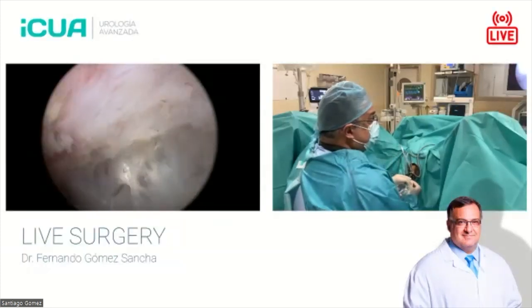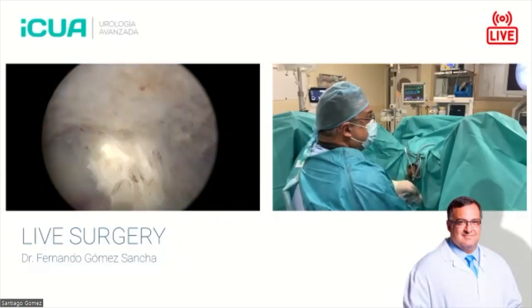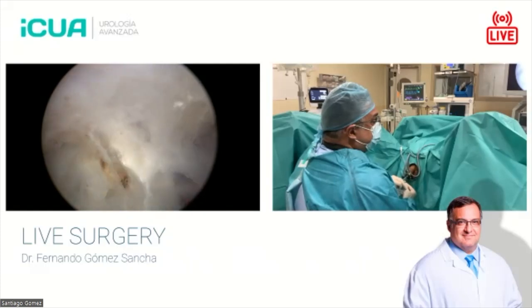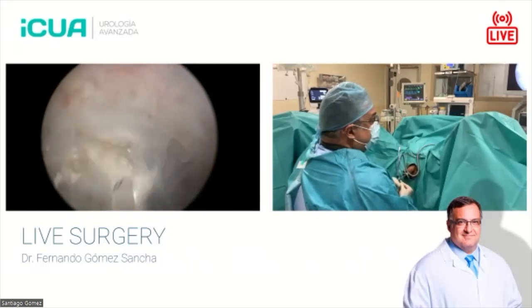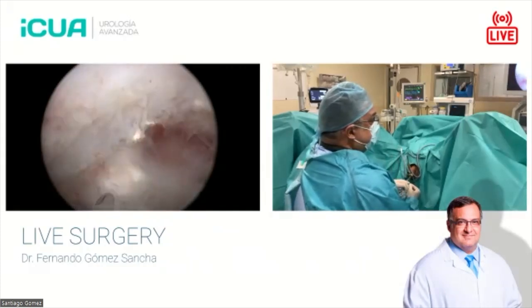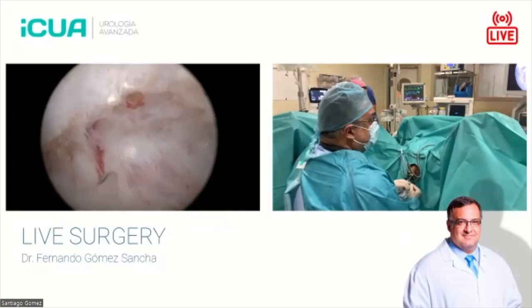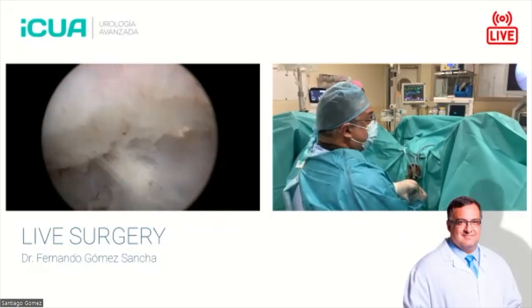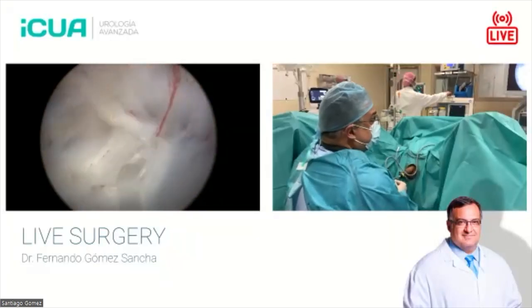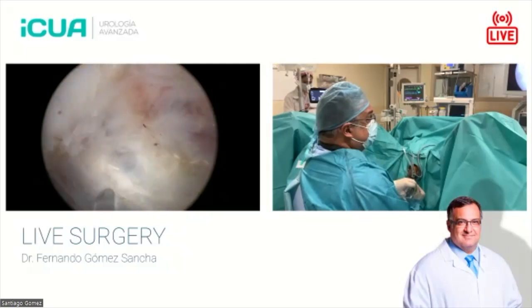Factor number three is going to be the speed of movement. You see, I'm moving my fiber from side to side. If I move very slowly like this, I will maximize hemostatic effect, so I will have very good hemostasis. But if I move a little bit faster, I will maximize the dissection effect, moving forward faster. So it's up to the surgeon to decide what speed of movement to follow. But it's important: two different surgeons using slightly different distances and slightly different speeds of dissection will do a totally different procedure, even when the wavelength and the settings are the same.